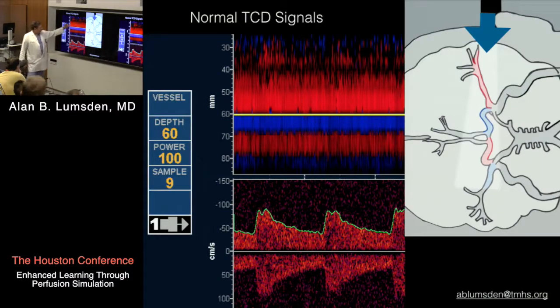So we can look at this, okay? Again, in this case, another type A dissection, complex thing. We're going to have to do a carotid subclavian, but the patient had a common carotid trunk. We were going to lose both carotids at some point in the reconstruction, probably not good. So we figured we could do a subclavian to carotid bypass while we disconnected the carotids, so that we would perfuse through the subclavian, up through the carotid subclavian bypass, into the carotid, into the head. Well, what about the right hemisphere?